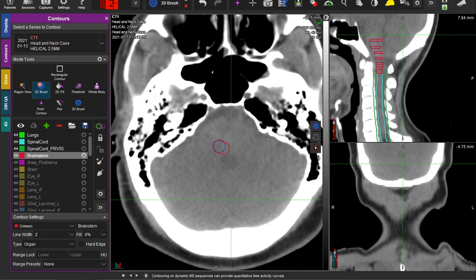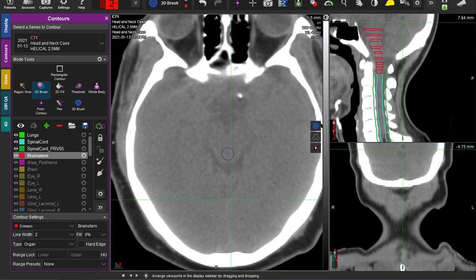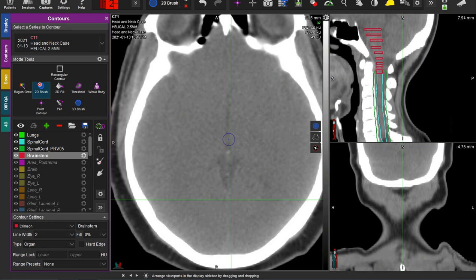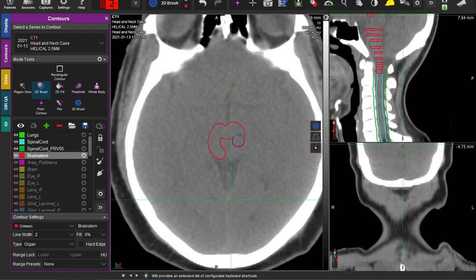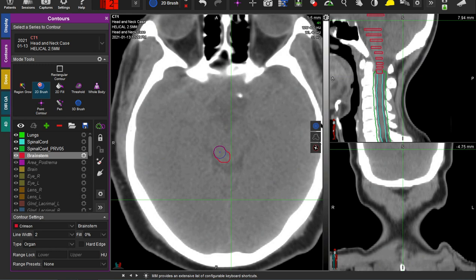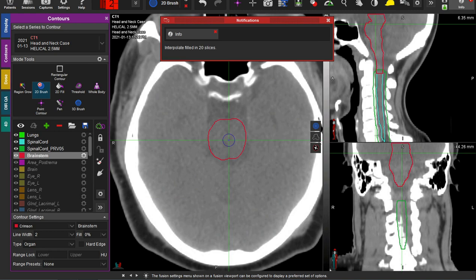So we're getting the brainstem — it's easier to see once you're up here. The question is where am I going to stop contouring up? Once you see this feature representing the ventricles, that's where you stop — the slice right below it is going to be your last slice. You can sort of see the outline of the brainstem there. I'll fill in the slices in between — you have the characteristic two humps — and now I'll interpolate.